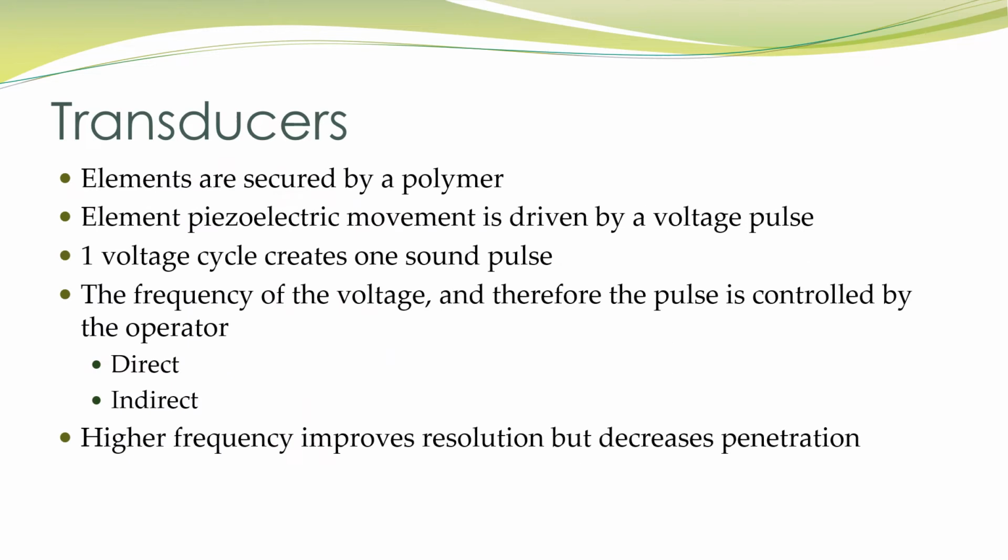Now, one important note about the piezoelectric elements is that because they're man-made under lots of pressure and high heat to give them those piezoelectric qualities, if we ever get that element up to the Curie point again, it will lose its piezoelectric qualities. So we have to be careful with our transducers. This is not something that you can put into an autoclave or something like that. Of course, in normal environments, they're going to do just fine, but it's something to be aware of anyway.